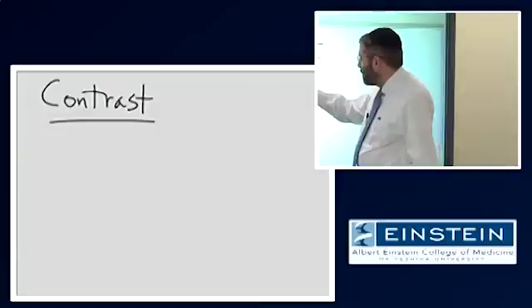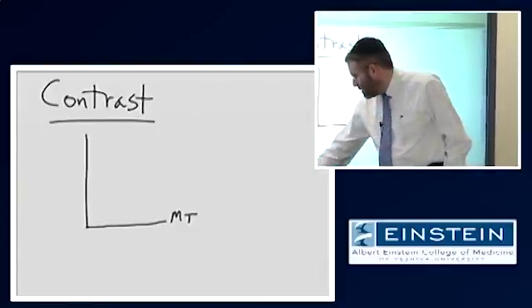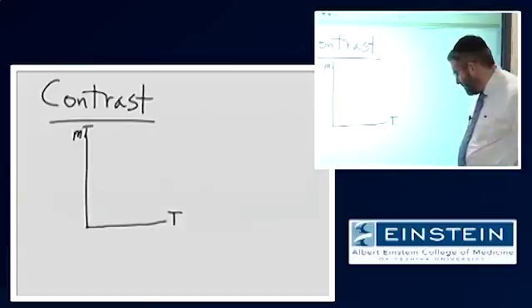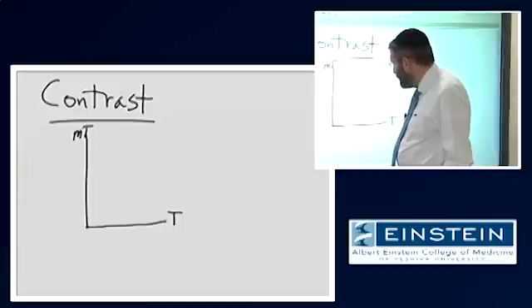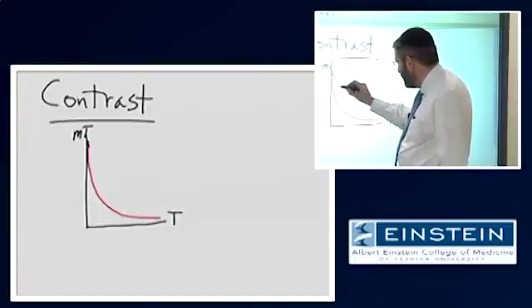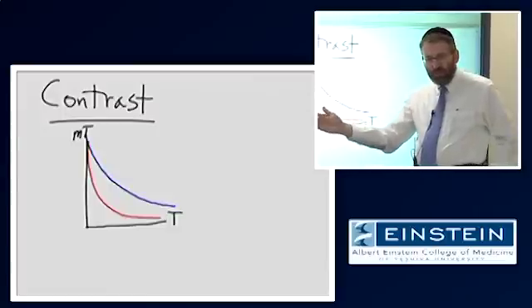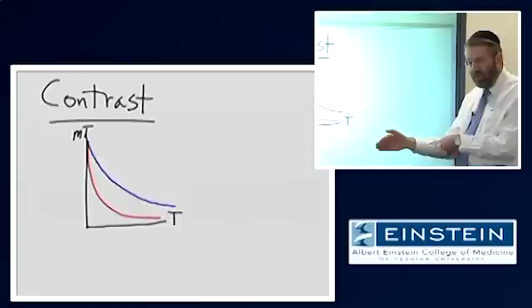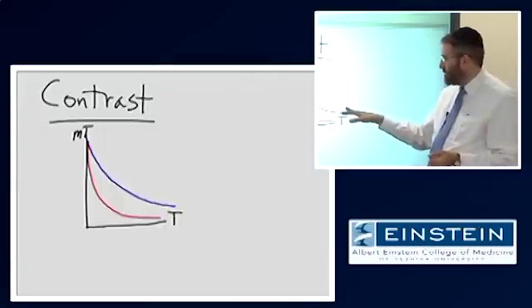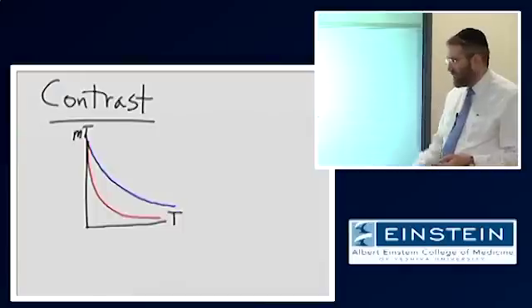So if we look first simply at what's going on with our transverse magnetization, what we've already said is that different tissues will have different exponential decays, representing what happens after we achieve this 90-degree rotation of the magnetization and we turn off the input energy, the RF, and watch things relax over time. There is going to be a different time course, even though ultimately, if we wait long enough, they're all going to asymptotically approach zero transverse magnetization.